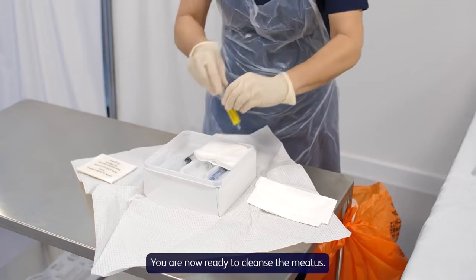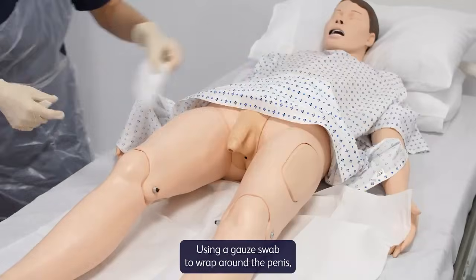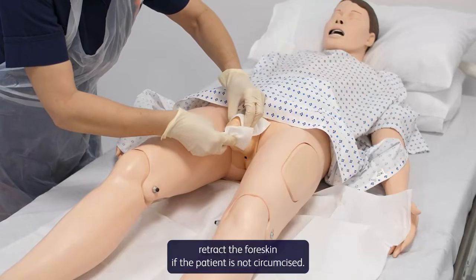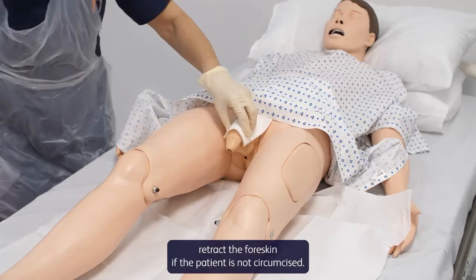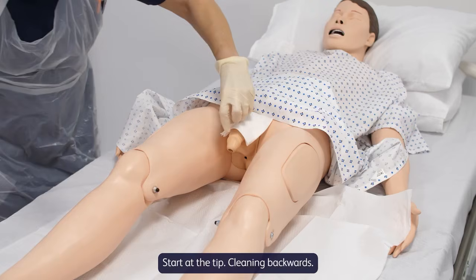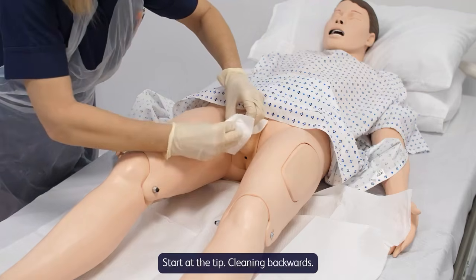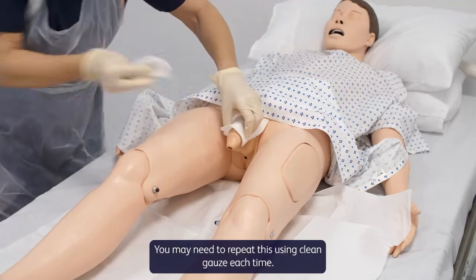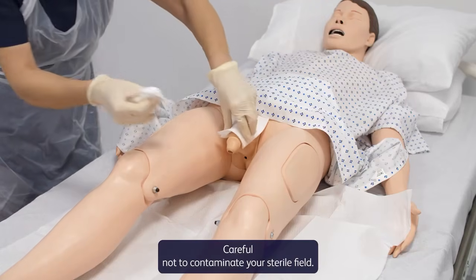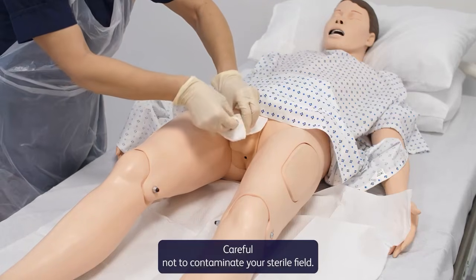You are now ready to cleanse the meatus. Using a gauze swab to wrap around the penis, retract the foreskin if the patient is not circumcised. You may now start cleaning the meatus. Start at the tip, cleaning backwards. You may need to repeat this using clean gauze each time. Dispose of the swabs in the waste, careful not to contaminate your sterile field.